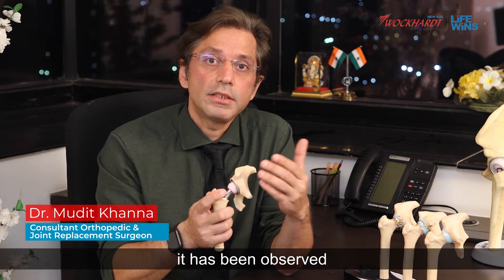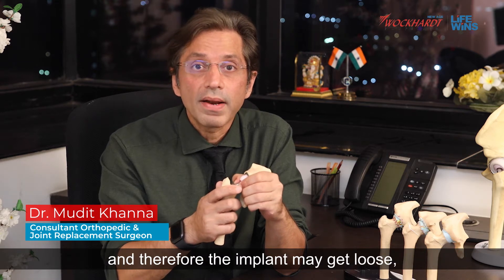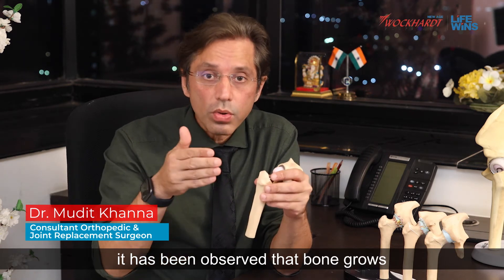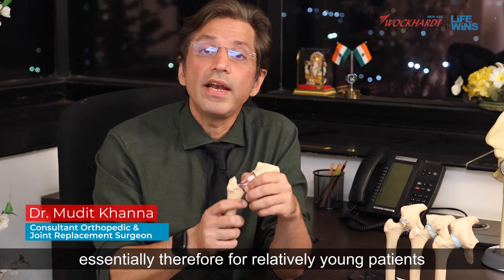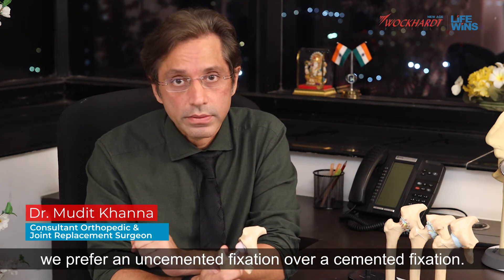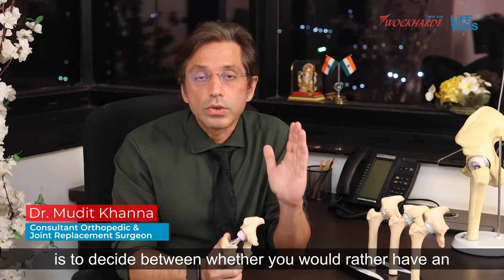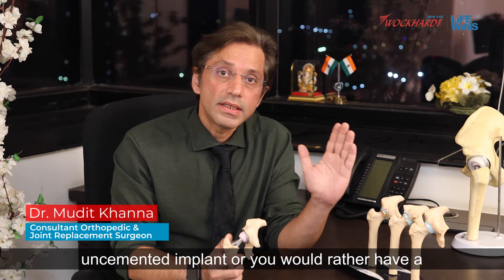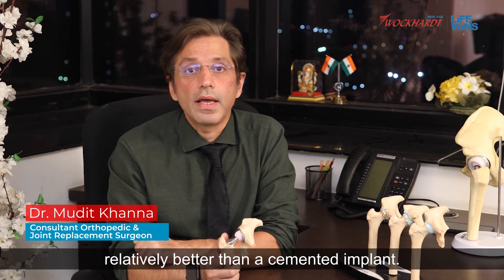With a cemented component, it has been observed that the cement may get loose over time, and therefore the implant may get loose. With an uncemented fixation, bone grows into the surface of the implant, making it more stable as time goes by. Essentially, for relatively young patients we prefer an uncemented fixation over a cemented fixation. So the first variable in your choice is whether you would rather have an uncemented implant or a cemented implant — for young patients, an uncemented implant is relatively better.